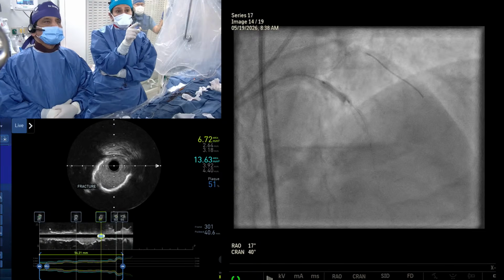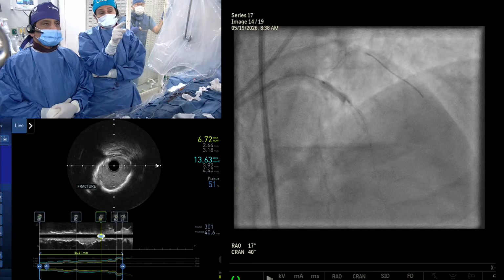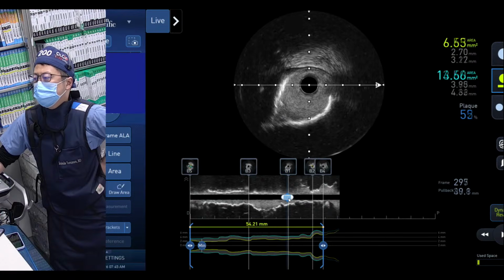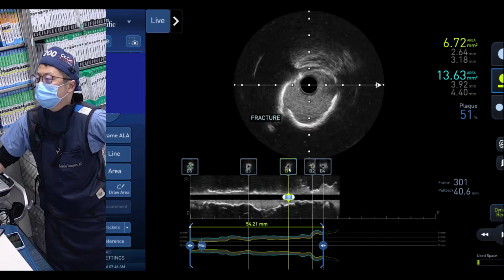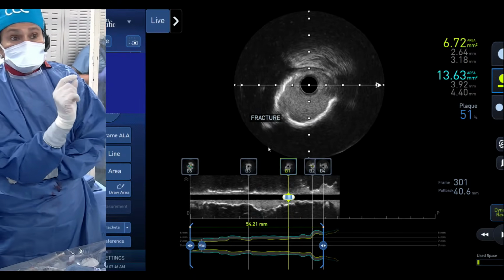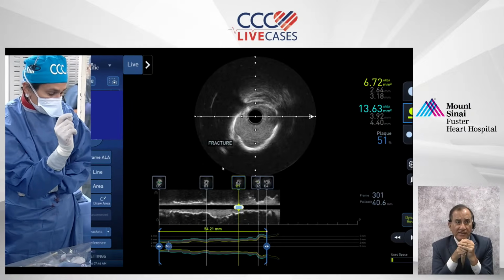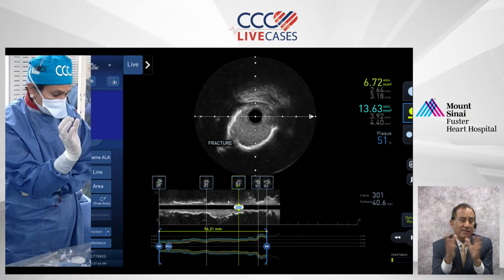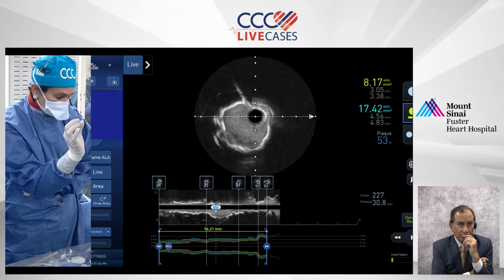Now go back there. See what he's teaching, showing there where he has made a point. That is close to, you see that? That is what we are saying is the fracture within the calcium plate. Anu, explain that one more time. 1:1, I understand. But if the arc of calcium is less than, let's say, 270 or something, why slightly smaller?